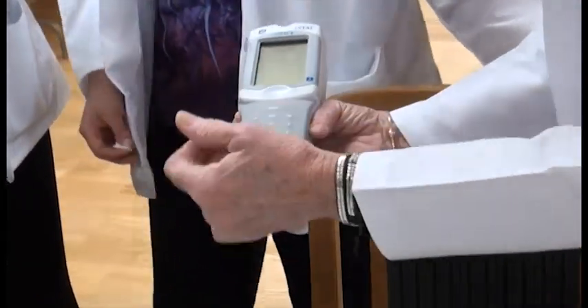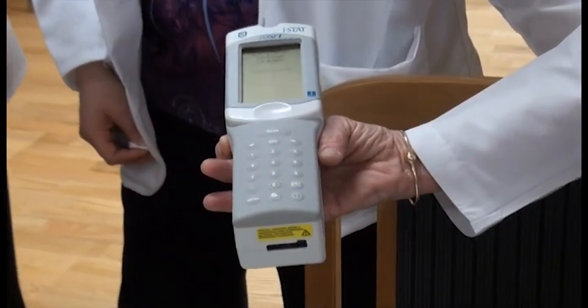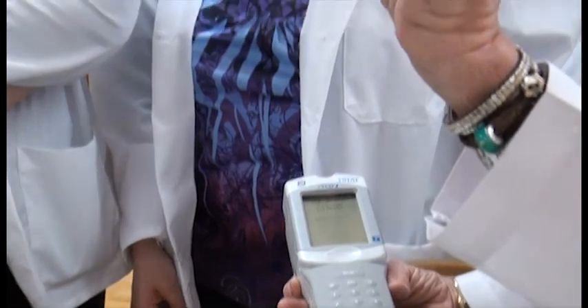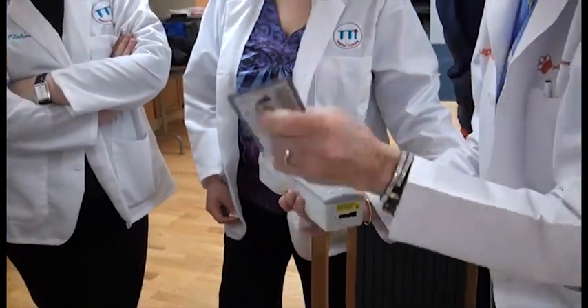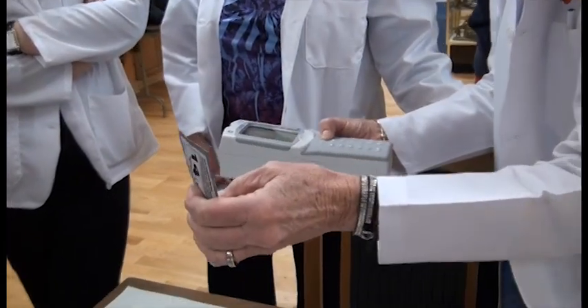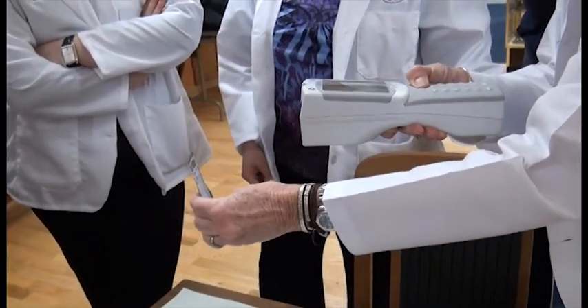Scan or enter patient ID. We don't have a patient ID, so we're going to hit enter. We do, however, have to scan the cartridge that we're going to use. You notice that there's a barcode on the cartridge. To scan the barcode, you merely hit scan and hold this in front of it.